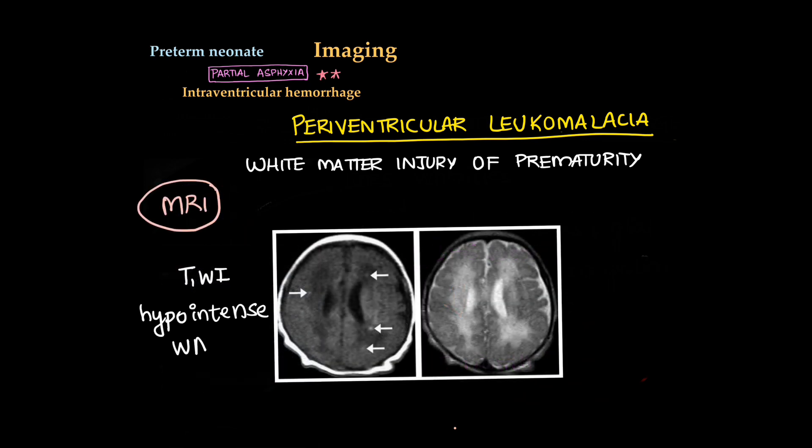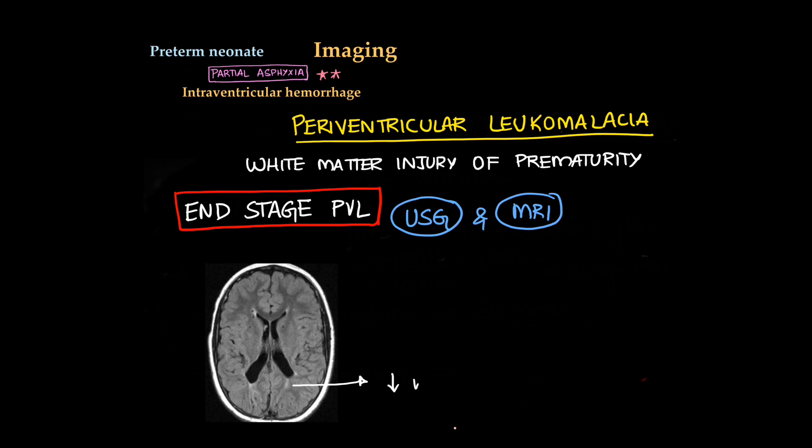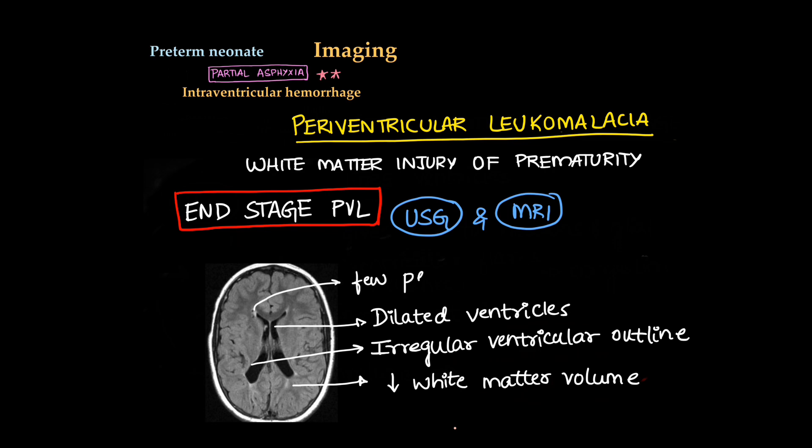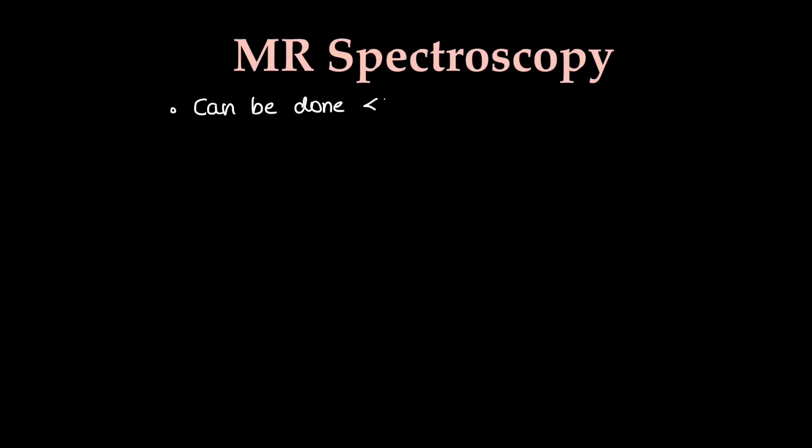On MRI, we can see T1 hypointensity in periventricular white matter. On T2-weighted, it appears hyperintense. What does end-stage periventricular leukomalacia mean? On ultrasound and MRI there are same findings. I will show on MRI. First, reduced white matter volume which can appear hyperintense. There are dilated ventricles, permanent dilatation, irregular outline of the ventricles. There can be some persistent cysts in periventricular areas. There can be atrophy of the brain matter also.